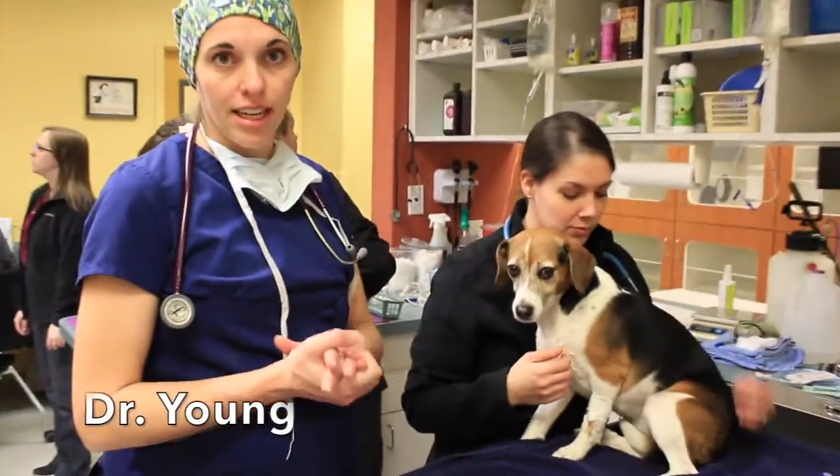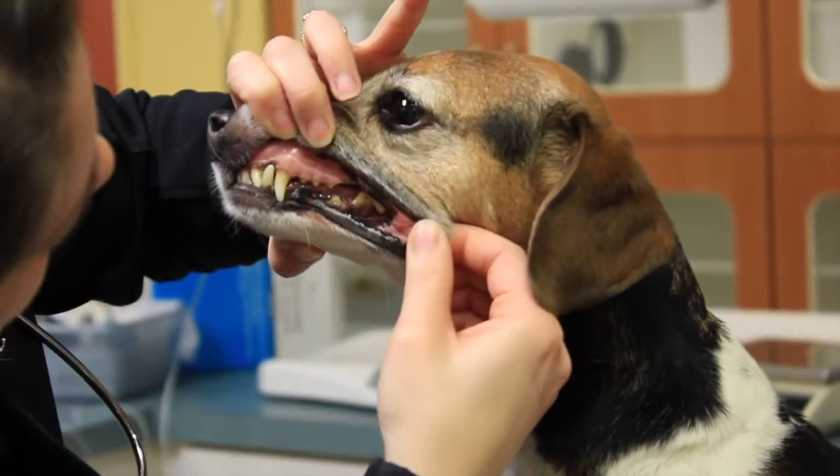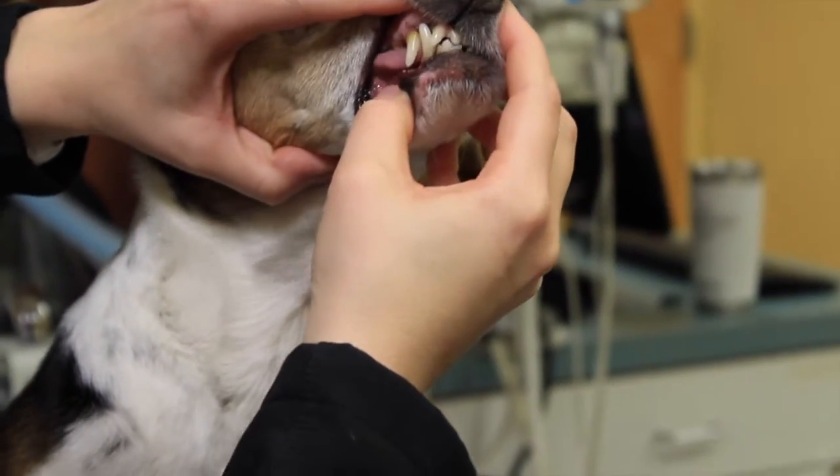This is Goose. She's here for a dental cleaning today. We've already done her physical exam and looked at her teeth, so we know that she doesn't have any teeth that we expect to need extractions. We're also going to remove a little mass on her ear.